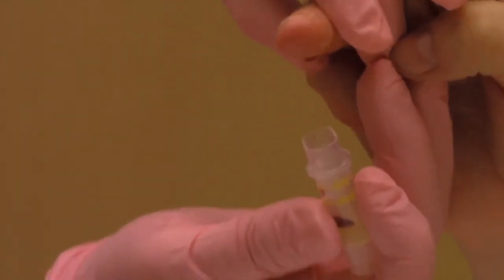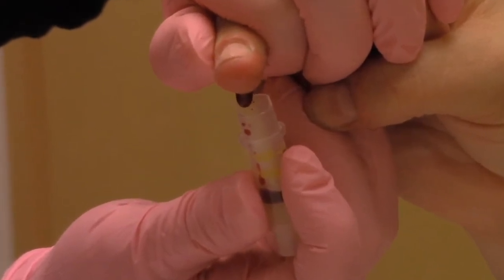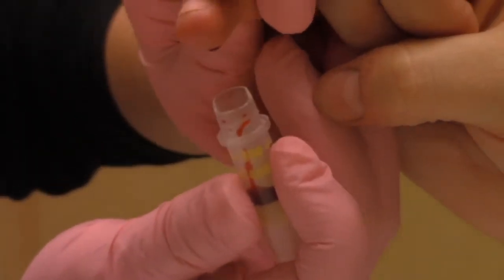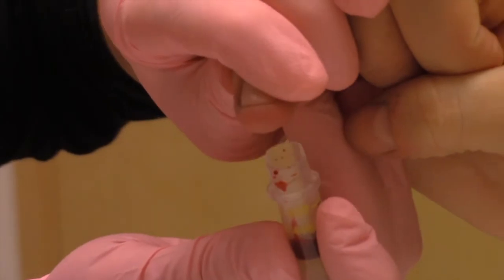Begin milking the fingertip like so and collecting the blood in the tube. If the finger doesn't seem to be bleeding enough, you can hang the hand down below the heart to let gravity help with the blood flow. You can use the gauze to clean up the finger if it is getting messy and to improve blood flow into the tube.